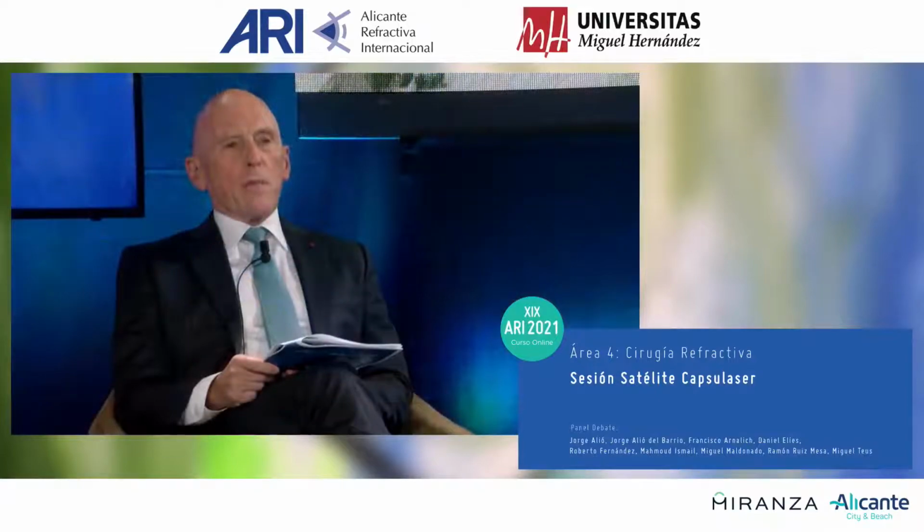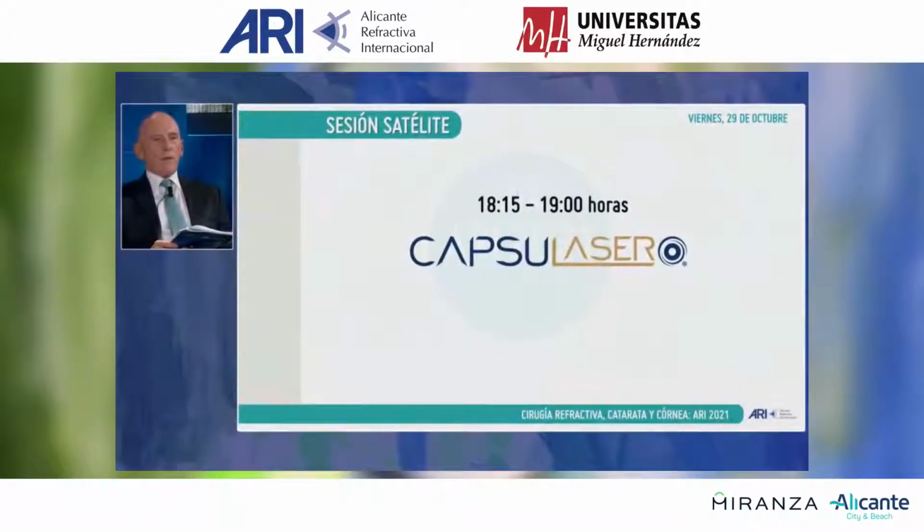Automatic capsulotomy is becoming a major issue because capsulorhexis is the one step that we really need to accomplish in order to create a much more controllable cataract surgery. With capsulotomy problems, there is just a small red line that makes a surgeon who has a problem with the capsulorhexis fail the cataract surgery. So controlling the capsulorhexis, its size, its shape, how it is performed, being fast and controllable, is indeed one of the major issues and accomplishments that we have to get in the immediate future to improve our cataract surgery.